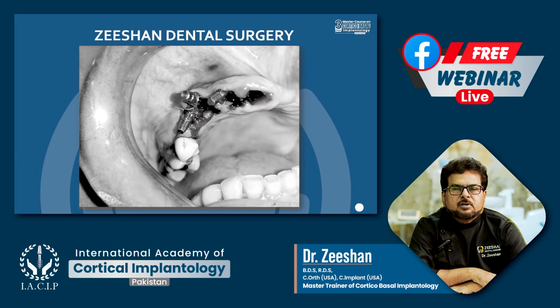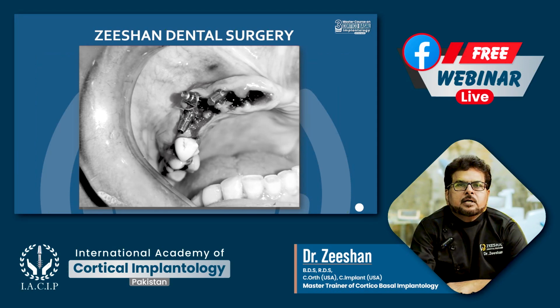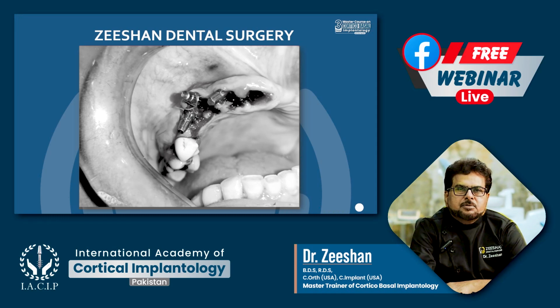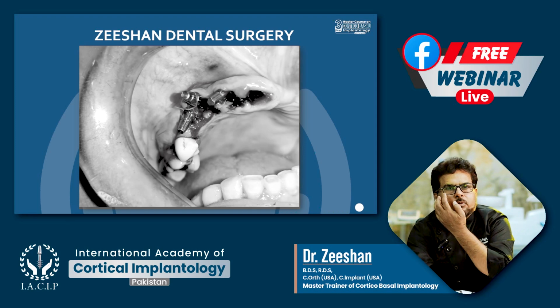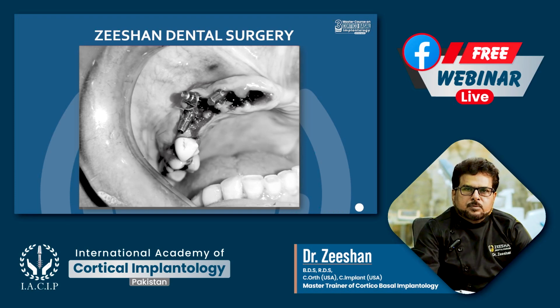Look at these implants placed at different angles. These are the techniques you have to learn for this immediate loading. Placing implants at different angles and then bending them and making them straight in the arch. It's an art. It has to be learned, and once you learn, you will enjoy this feeling as well as restoring your patients with teeth immediately in 72 hours or so, depending on your labs.